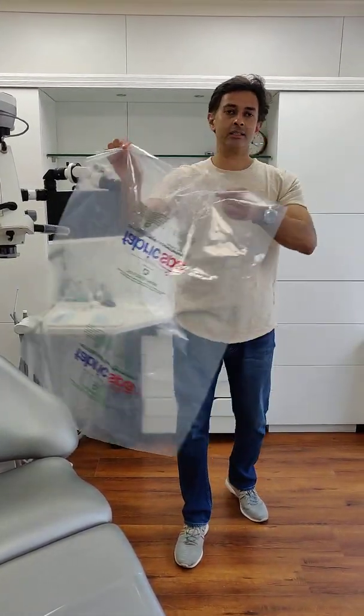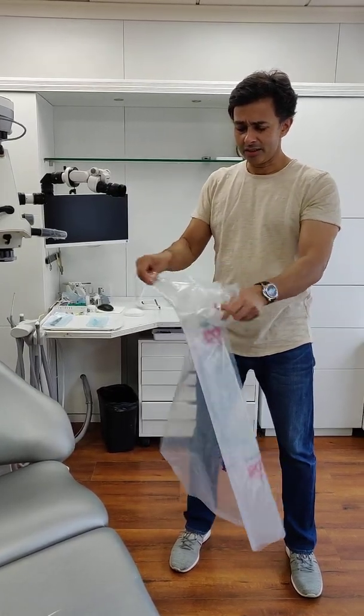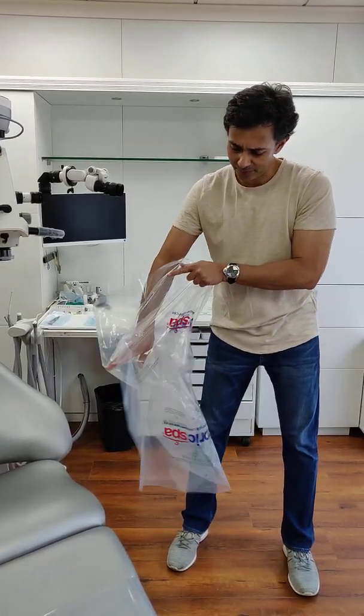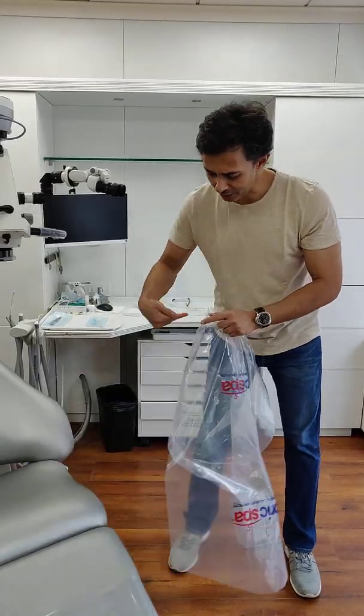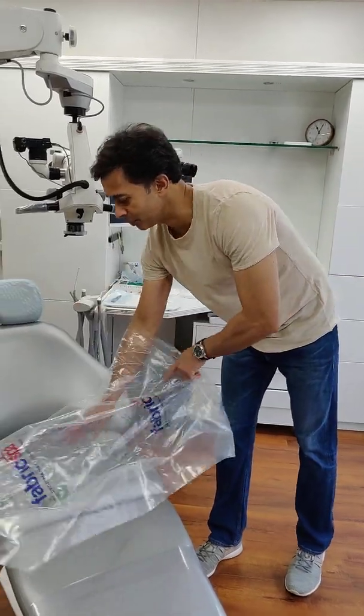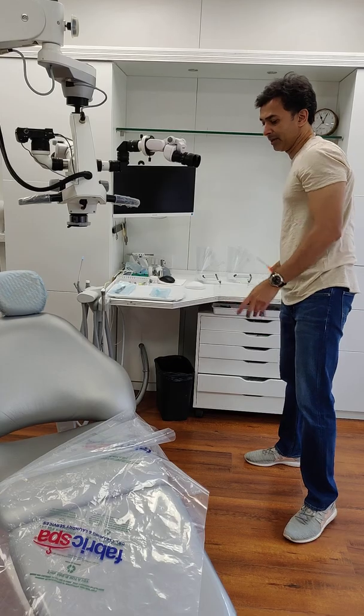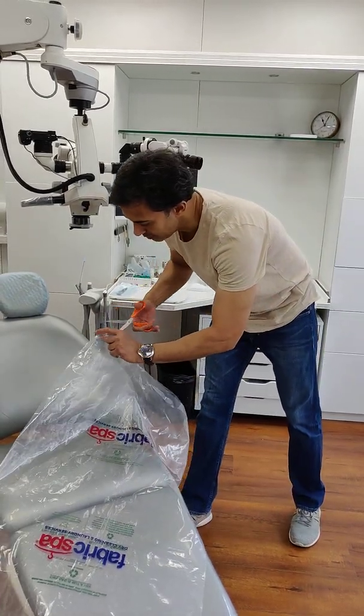What we do is we take these plastic laundry bags and we open them up. Then we kind of give a release on one side, just so that you can manipulate these easily. What you need to do is cut this one part off with a scissor, and then just give some relief there.